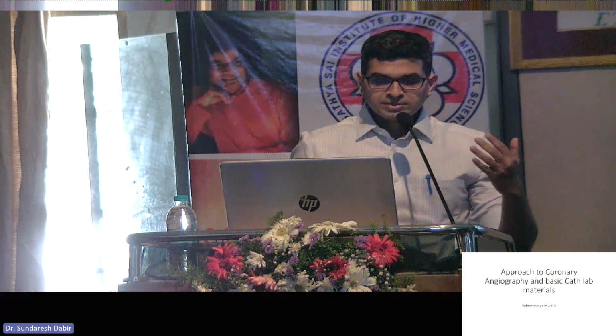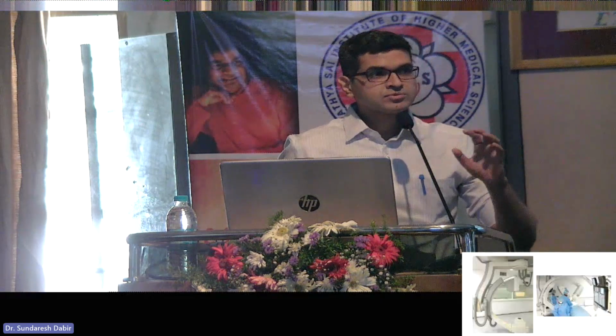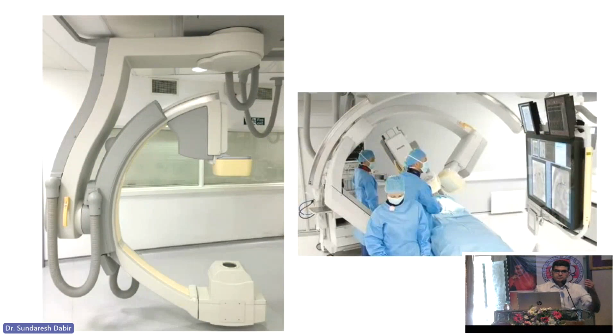we are taking 2D images of a 3D structure, right? That is the biggest problem. That is why we need to take these multiple views to profile a 3D structure. We need to take a LAO, RAO.